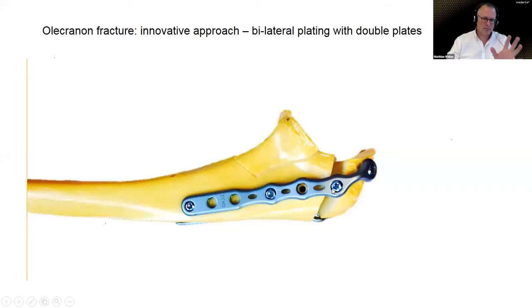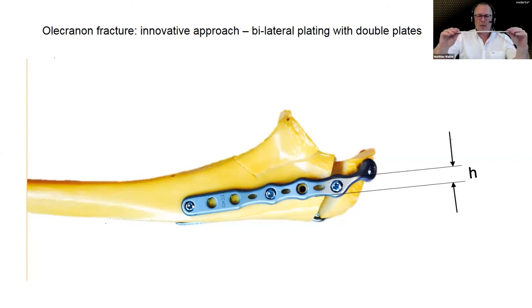Because otherwise you cannot just implant the material. And you will now see that even with the plates on, not the thickness of the plate is actually the stabilizing factor, but here it's actually the width of the plate, so how broad the plate is, since we don't need to place it flat, but we can bring it 90 degrees to that. And this means this plate is so stable because it has a certain height, okay?